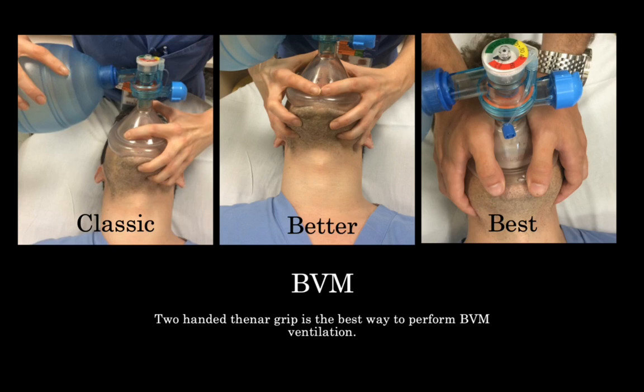Now, many people say, we just don't have the people power for this. We only have one person to bag a patient. And I will argue, unless chest compressions are being done, if bagging isn't going well, nothing else on a scene matters. The only thing more important than oxygenating and ventilating my patient is performing chest compressions. Once you know you're oxygenating and ventilating, now you can move on to other tasks on the scene.